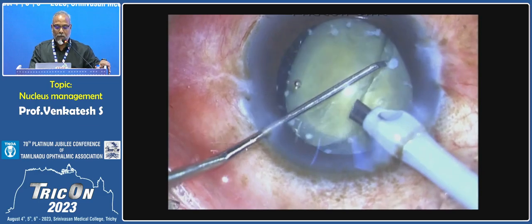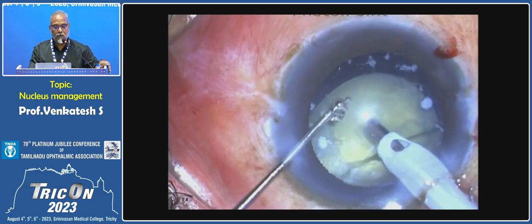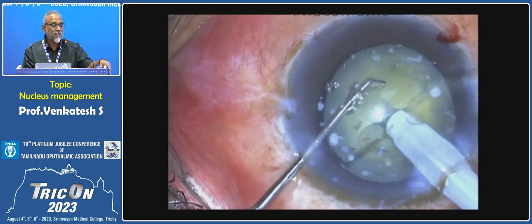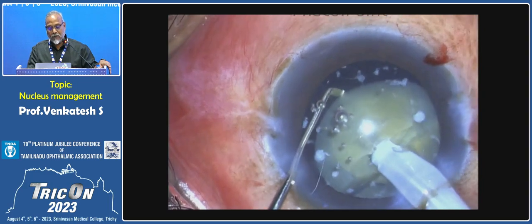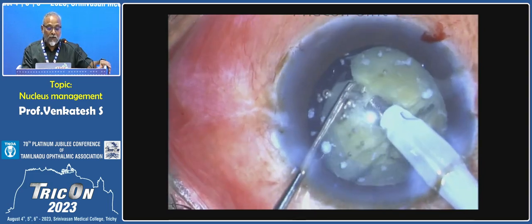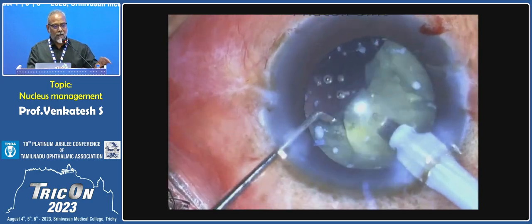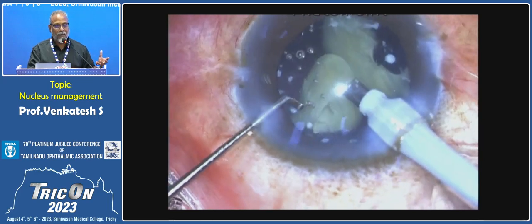Now the difference between blunt chopping and direct chopping is that in the direct chop, you use shear force. That is, you hold, you lift, and the chopper moves downwards. Whereas with a blunt chopper, you use something called compression force. You take it to the periphery and bring it towards the center, which is much safer when it comes to protecting the posterior capsule. Of course, the advantage in a Morgagnian cataract is that the edge of the lens is clearly visible, so you don't have to fish blindly in the periphery.